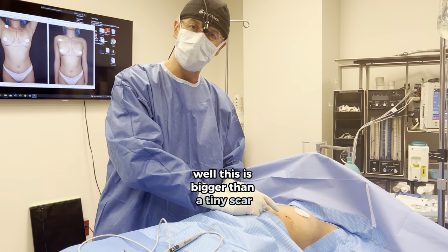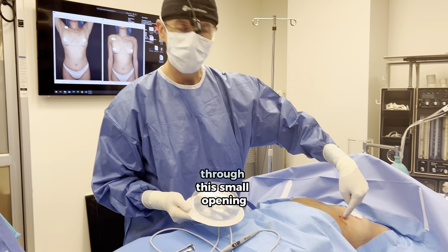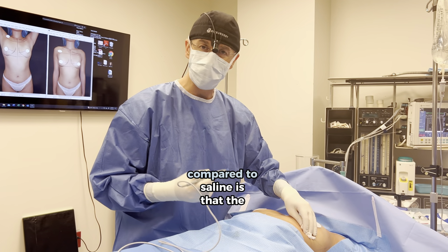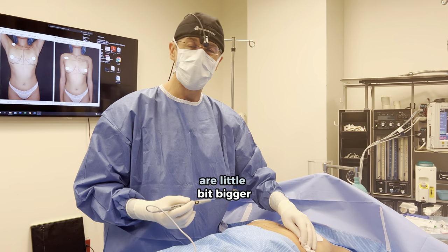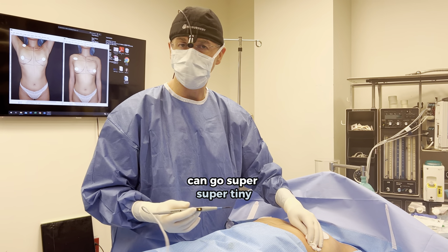Now this is bigger than a tiny scar because we're using silicone breast implants — I'm gonna squeeze this big thing through this small opening. One of the downsides of a silicone breast augmentation compared to saline is that the scars are a little bit bigger, sometimes up to twice as big, because with saline I can go super super tiny.